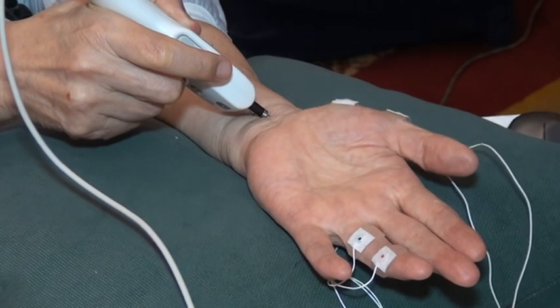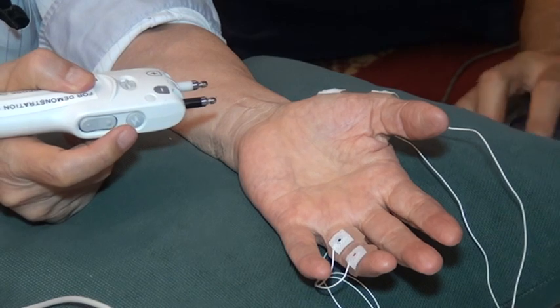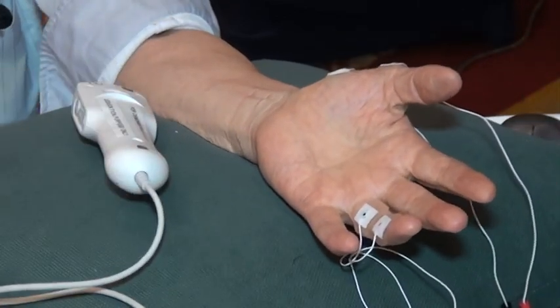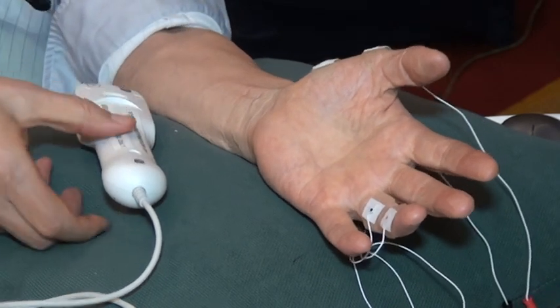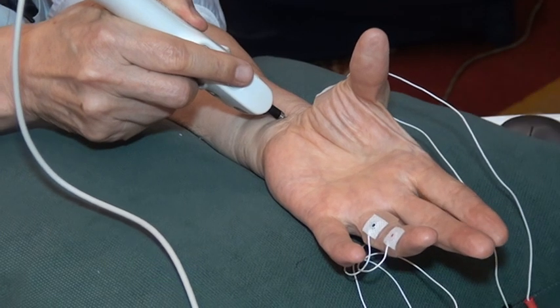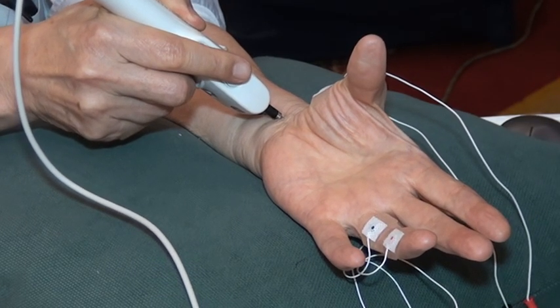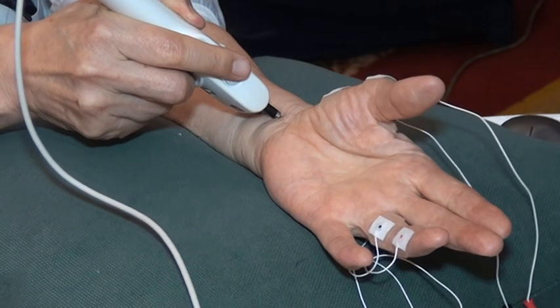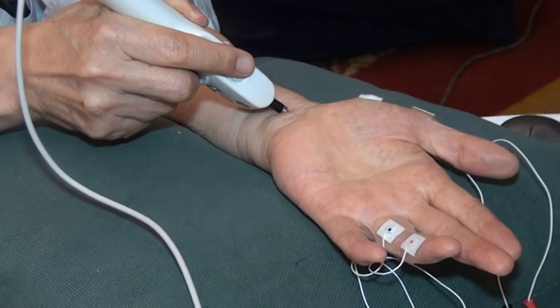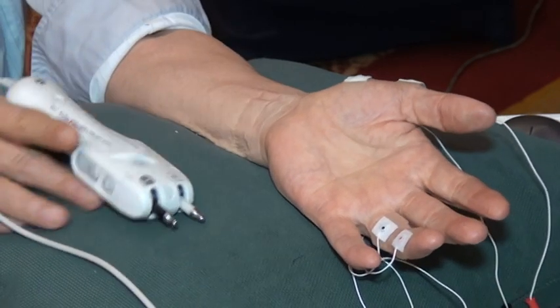No, you have to do it in a... Sorry, this is the one. Okay, so what happened here? Oh, you erased it. I will erase it from the beginning. Okay, just a minute. Tell me when. Yeah, stimulate. Okay. This one was not as good, but that's okay. See what happened here?